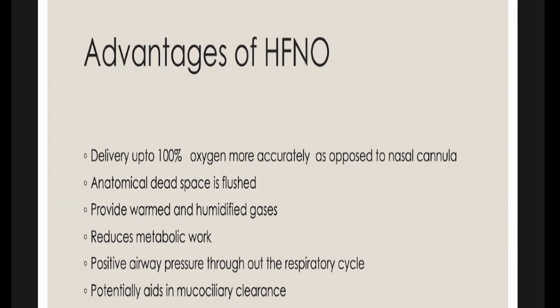So inside the nostril, you have a dead space, isn't it? There's a little dead space in the nostril. If you imagine the concha and the sinuses openings, that area is a little dead space. So imagine if somebody is breathing in, the first bit of air that is coming from the environment is the bit of air that is at the nostril or at the nasal cavity. So what the nasal cannula does is, it keeps this nasal cavity enriched in oxygen. Because it cannot reach the lungs, obviously, isn't it? Can the nasal cannula, these 4 liters of oxygen, can it reach the lungs?